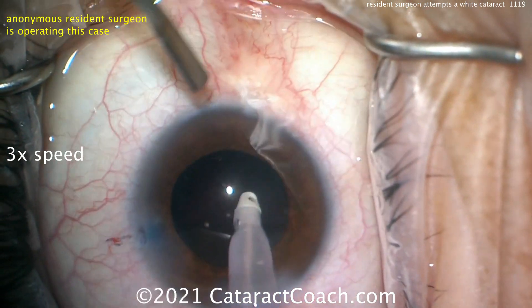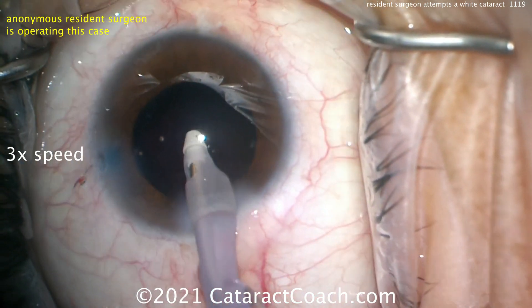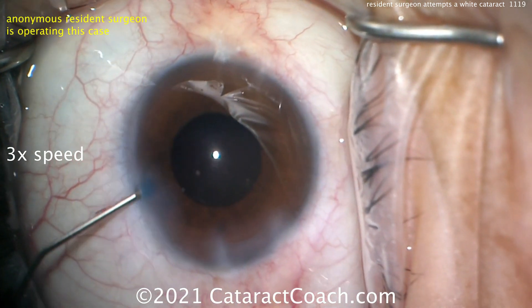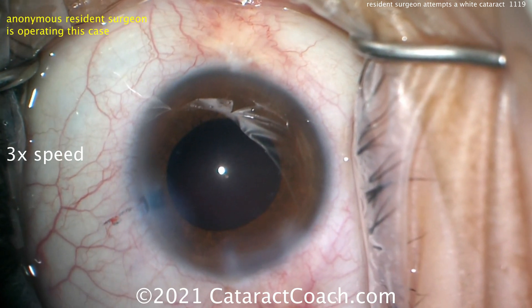Cortex is coming up pretty nicely — that looks great. Now cleaning up. Here's where you may have better luck using your left hand with the chopper to help lift the iris, because the pupil is coming down. Cleaning up the sub-incisional space — notice how when the probe goes in the eye, the infusion pressure helps open up that pupil.